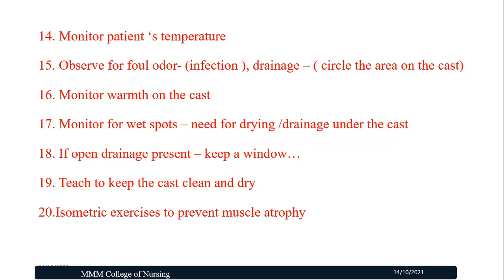It is also important that a cast is not heated with an artificial method, because the outer side of the cast will be dried soon with the heat applied, but the inner side will remain damp and can cause cracks in the cast. Monitor the warmth of the cast.